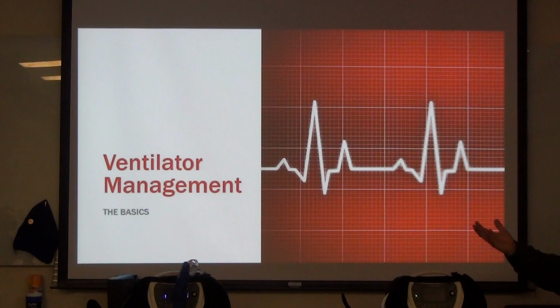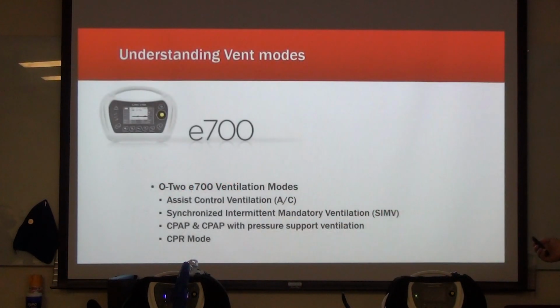In the future, we see expanded protocols. To answer your question, I already know that some of you are thinking this, that with these, we'll have expanded protocols to even use these in scenarios such as, okay, Michael, I see it already in your eyes, CPR, right? Because it has a CPR mode in it, so it can ventilate asynchronized or synchronized with your 30 and 2 compressions. It has that option. It also has the other modes, which I'll just go ahead and move into.